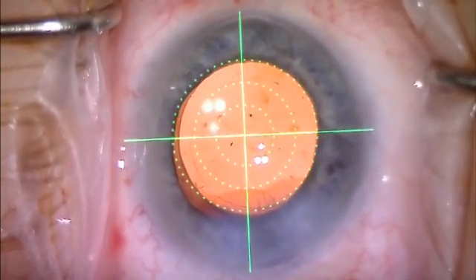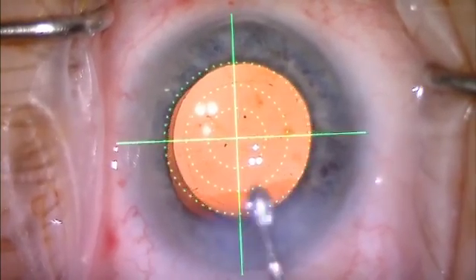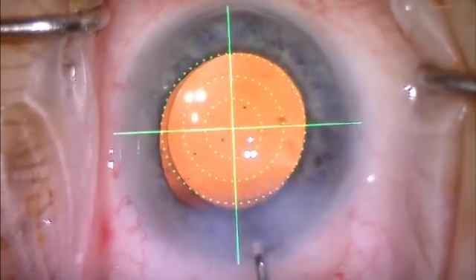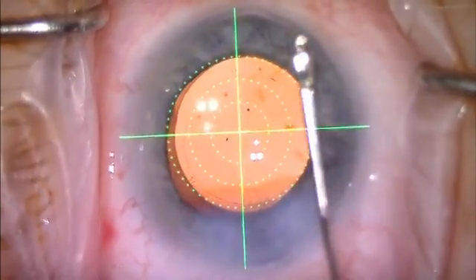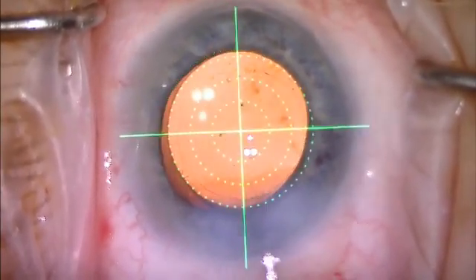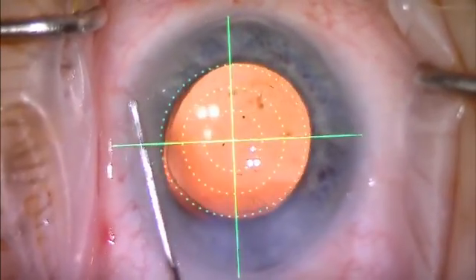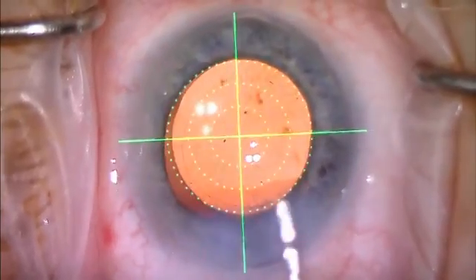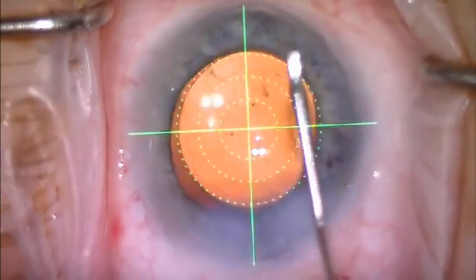So not only do we not have to mark for toric lenses, here we can be fairly certain of our centration. So I see a tremendous advantage in that. You can see how it's perfectly centered. And again, remember, this patient's had a block, and that has not affected our ability to center the lens, nor would it have affected our ability to locate a toric lens on the intended axis exactly where we want it.